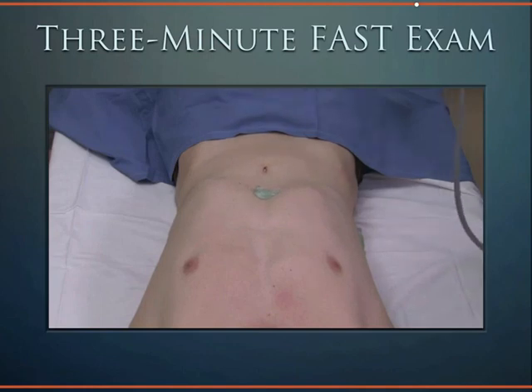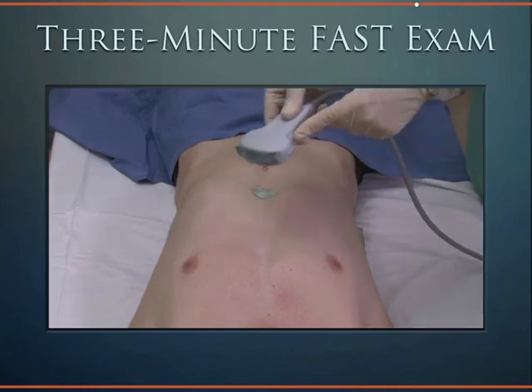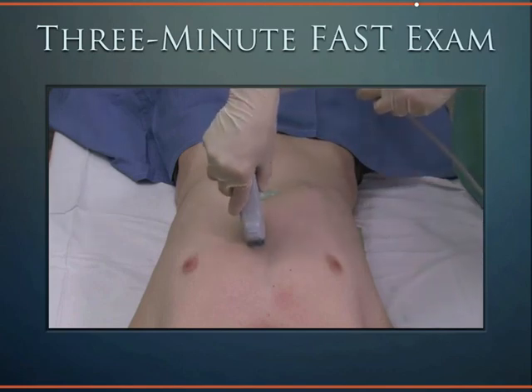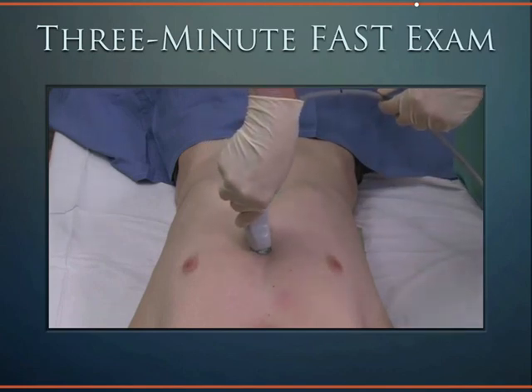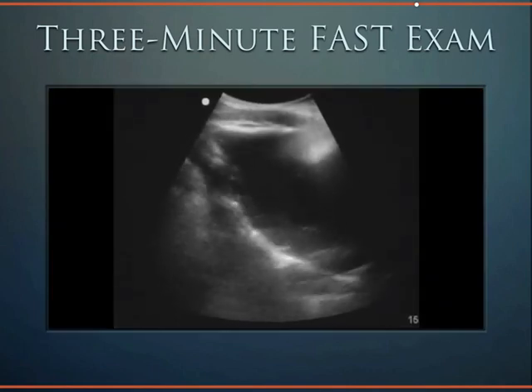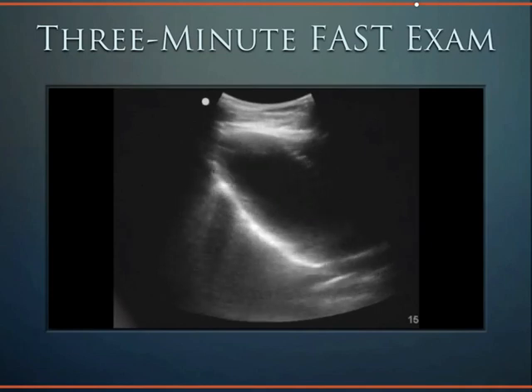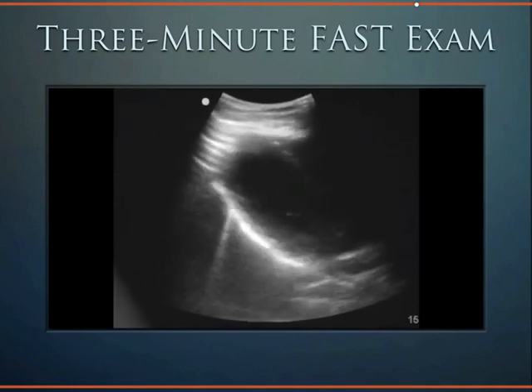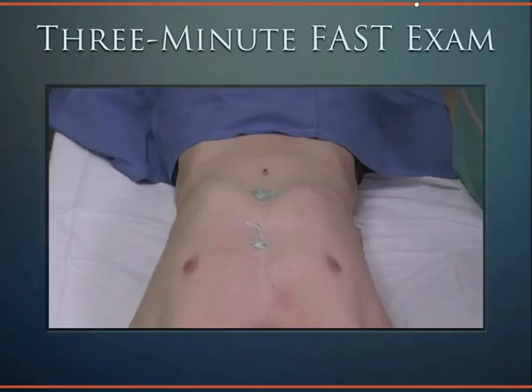The next window of the FAST exam is the peristernal long window of the heart. Place the probe with the indicator towards the patient's left hip. Place the probe right on the sternum and then slide off until you see the long axis come down the screen. You have now obtained a long axis view of the heart with the indicator towards the patient's left hip.